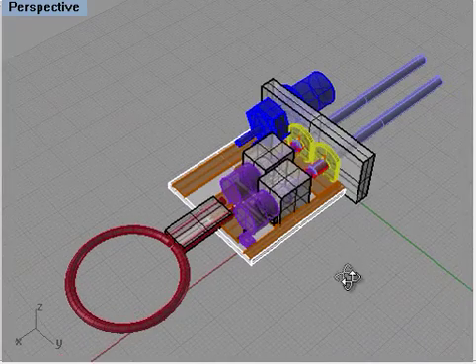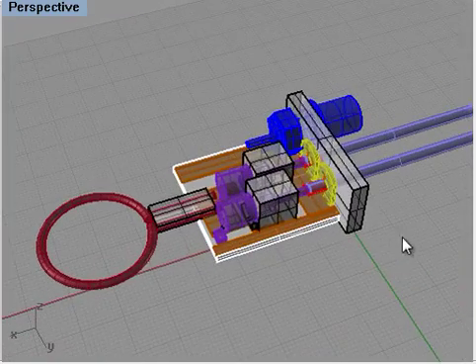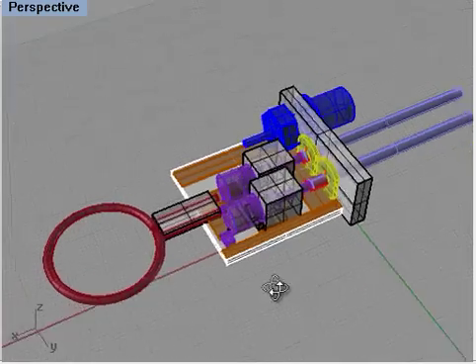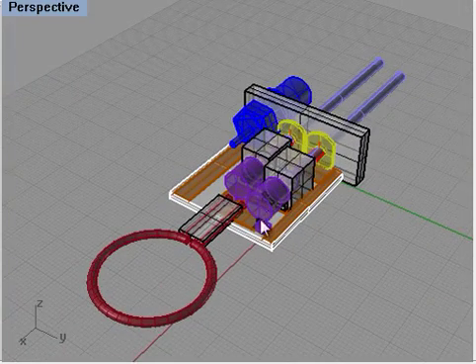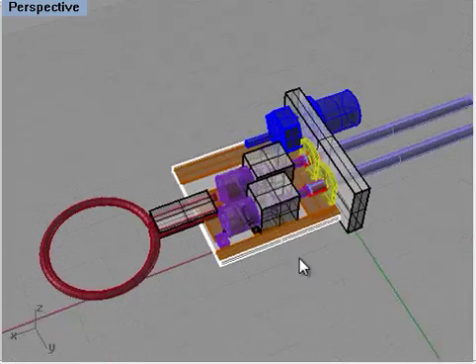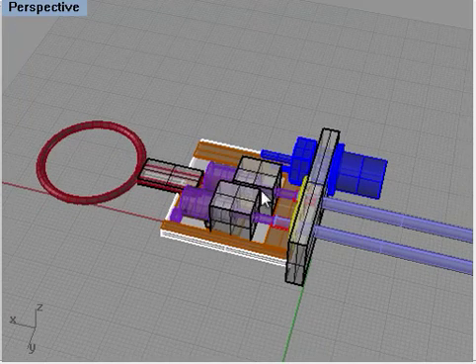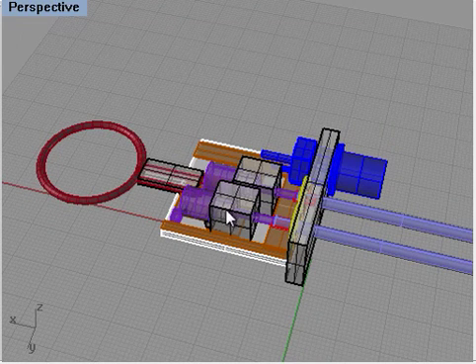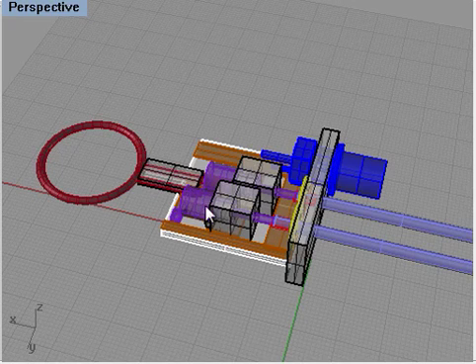If you remember from the lecture notes, we looked at the matching network. That matching network had adjustable capacitors. The adjustable capacitors in this circuit here are these purple discs, or purple cylinders. And these silvery blocks here are used to fix the capacitors in place, because these are of course adjustable capacitors, so they're being turned by a shaft.